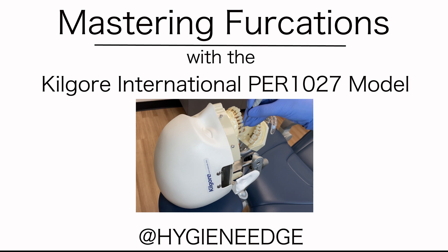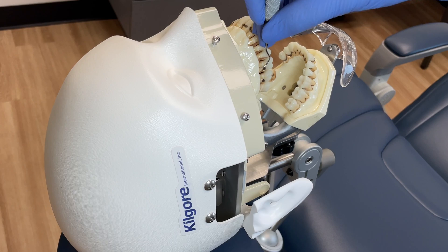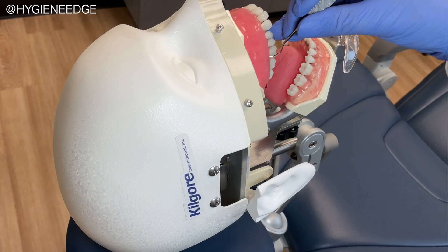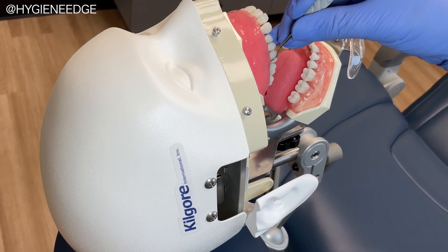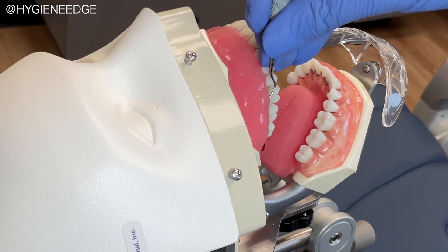Nothing is trickier than dental hygiene instrumentation around furcations. With some practice though, you can do it. Let's walk through how to instrument each furcation type on the Kilgore model PER1027 — the perfect model to practice furcations on if you're feeling unsure how to instrument these areas.